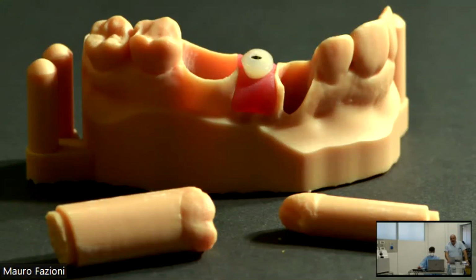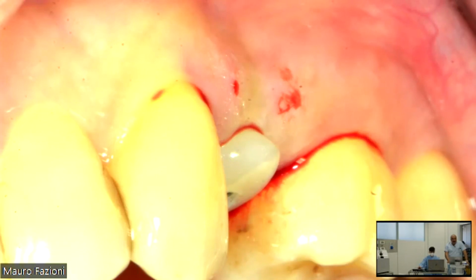Here is the 3D model, okay? And here you can see the emergence profile transfer on the healing, okay?